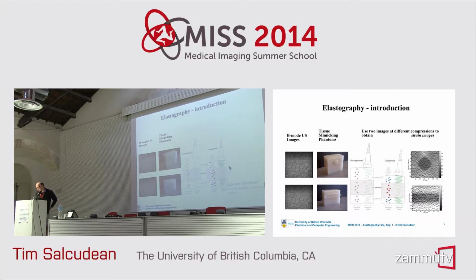It's like having 3 springs in series. Obviously, the stiff one will compress less. So you can take the differences between the images and obtain a strain image which shows you much more detail than you would have expected from the B-mode image. And that strain will show that it's lowest within the circular enclosure. So the difference between uncompressed and compressed will be higher outside the stiff region than it is within. And that makes perfect sense.